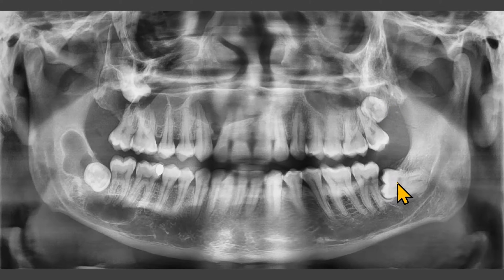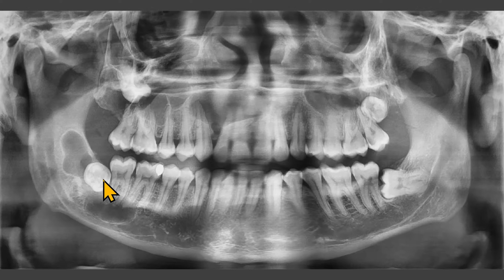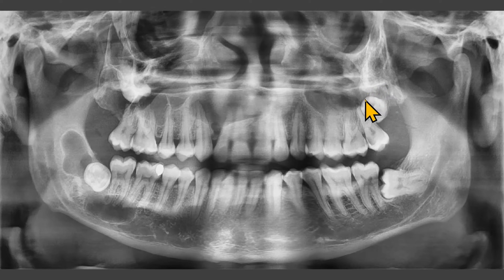The mandibular left third molar is horizontally impacted and the follicle looks normal. On the right side, we have a scalloped lesion extending from the area of the first molar all the way to the midramus. On a periapical interpretation video, we had learned that odontogenic keratocysts are often tunnel-shaped, running along the length of the bone. Let's review the CBCT scan. There is a large odontogenic keratocyst with this left third molar that was not visible on the panoramic radiograph. Therefore, in complex cases like this, a CBCT scan is important in addition to the panoramic radiograph.